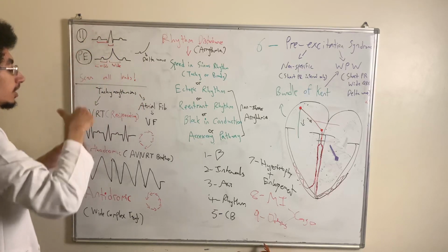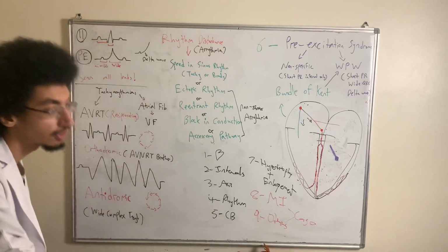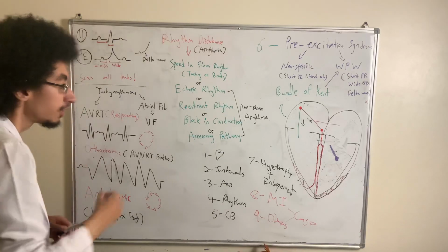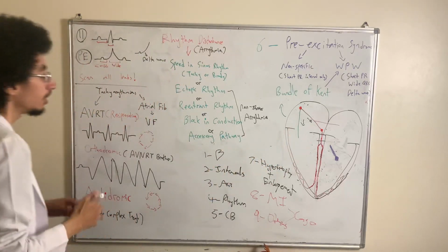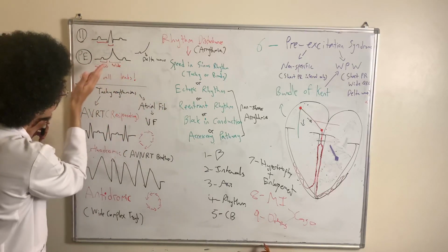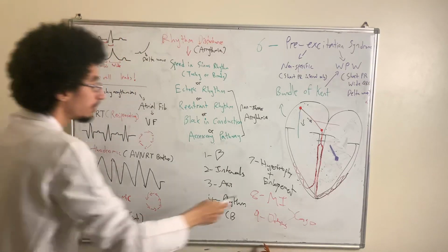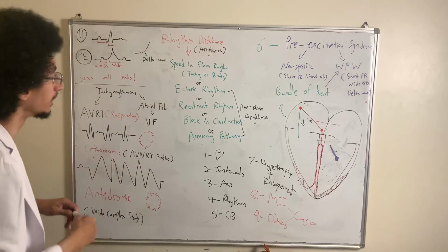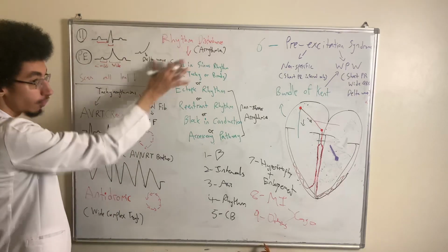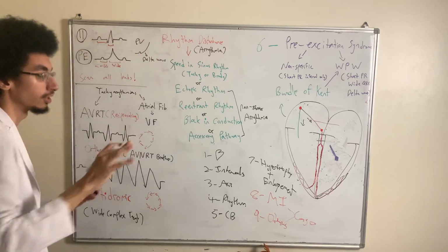So instead of the R wave or the Q wave going upwards immediately, it will cause an initial upstroke. And since premature activation of the right ventricle is occurring very early, it will give us an upward deflection gradually, Mumtaz, a little bit gradually. At the same time, while this delta wave is developed, the remaining left ventricle is being depolarized. So it will continue. If I were to just draw it more specifically, this delta wave right here represents right ventricular depolarization early.